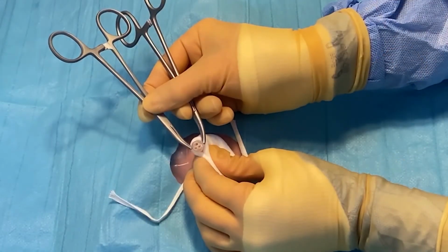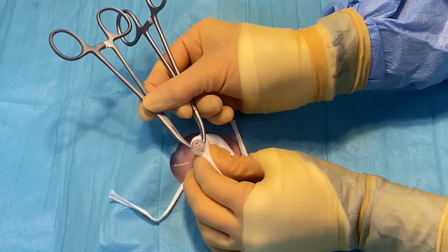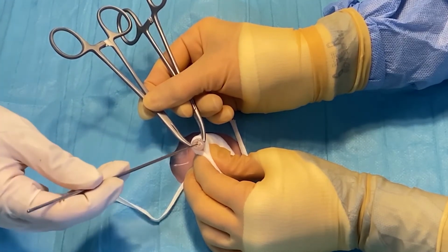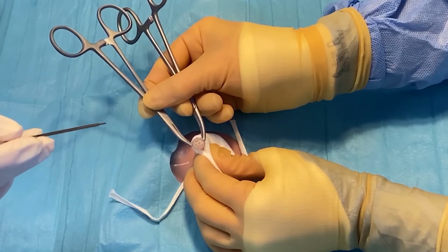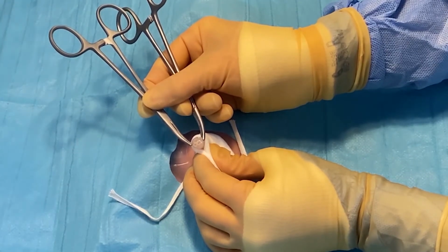So now it's time to insert our lines, and I'm going to start by inserting the UVC. So I've located my vein, and I'm just going to very gently dilate the opening. It's important that this isn't inserted too far or with force, as you don't want to create a false passage.